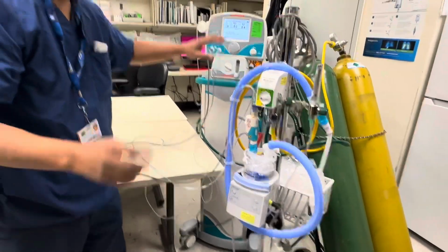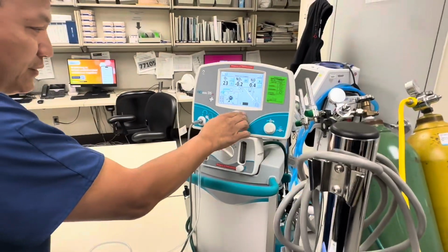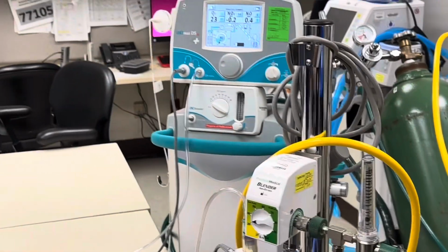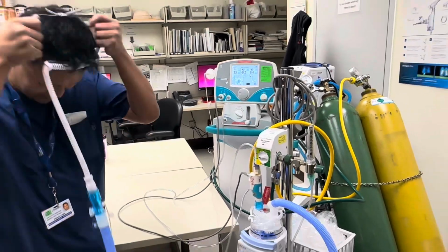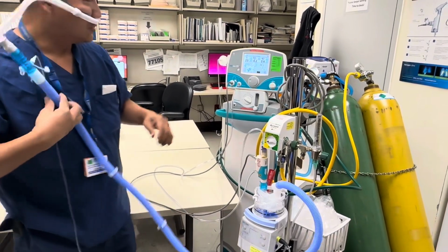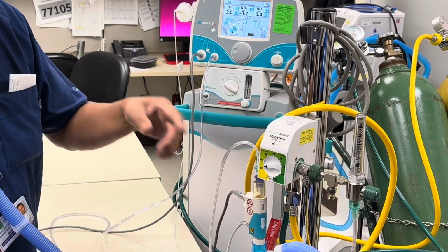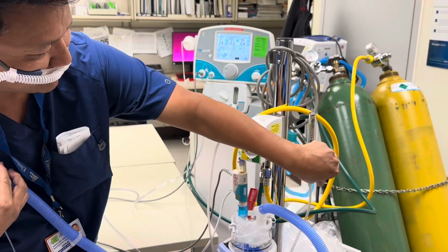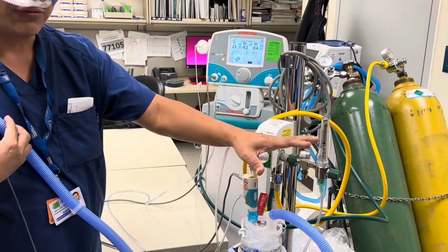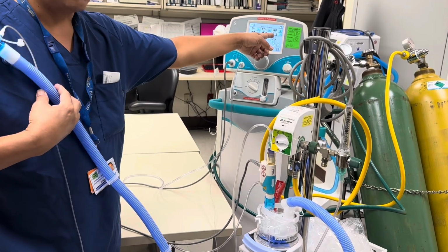Okay, that's good. So watch this. Watch the magic here. So I'm gonna go here. I'm gonna turn to number 5. Okay, and then I'm gonna put it on me. You can see. It's gonna make Mary laugh. Okay, so here. We're gonna have to connect something here. So now I have it at 5 parts per million, and all the connecting is done. And then flow is set at 4, 4 or 5 is fine. You need flow that's enough to reach 5.